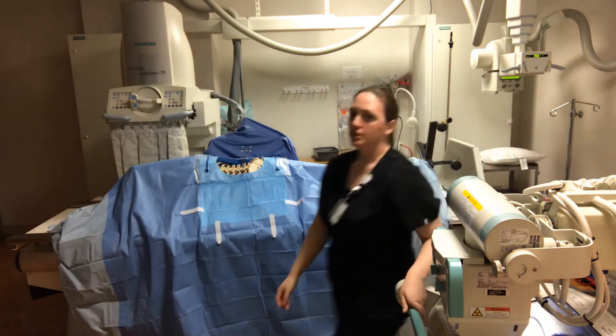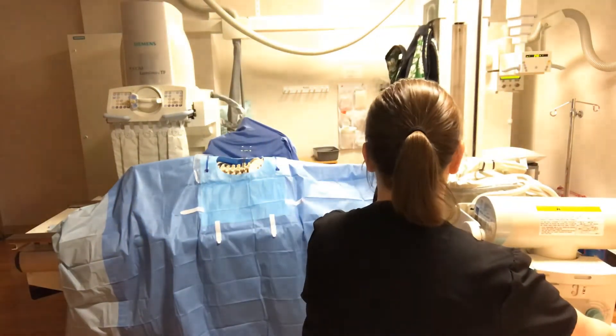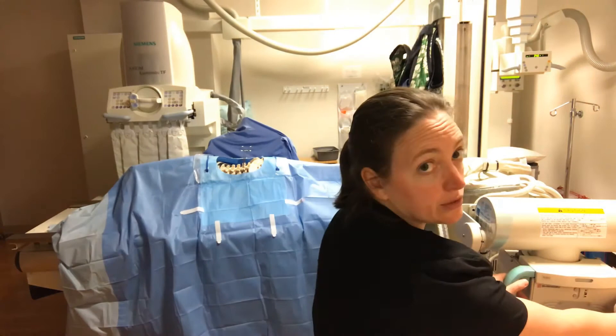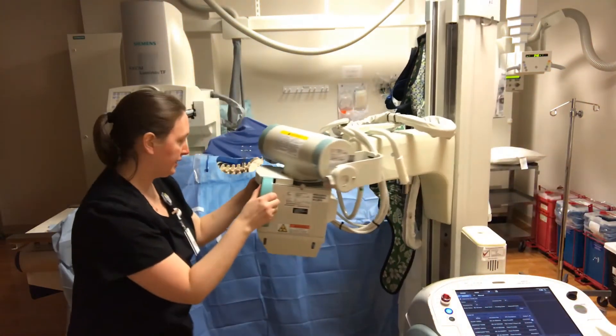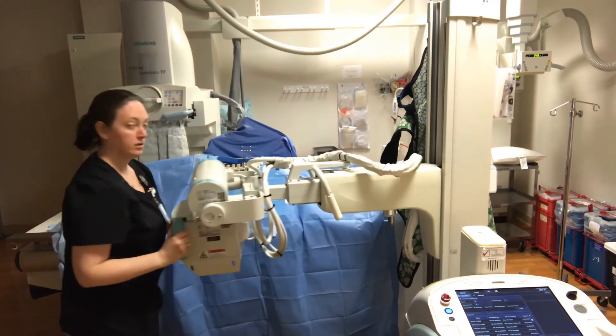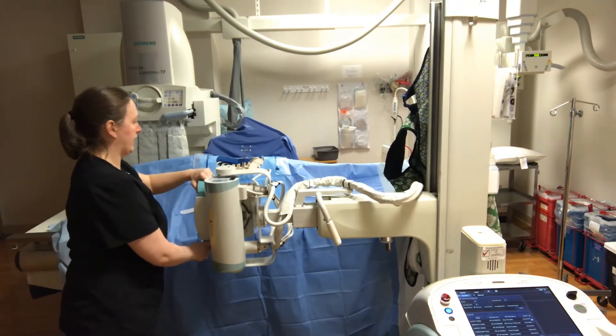Your portable machine — park it perpendicular to the table at the foot end. Don't pull too close to the sterile field. Pop the silver buttons out, bring your tube out, and rotate to your lateral.